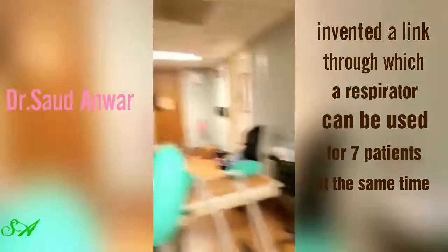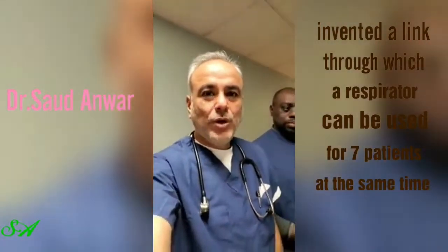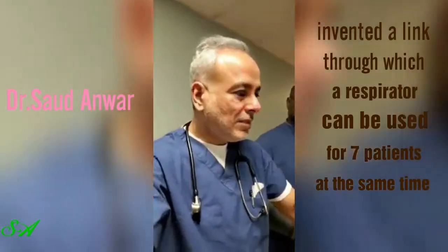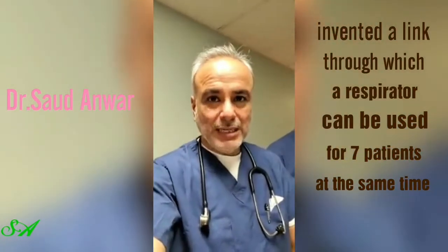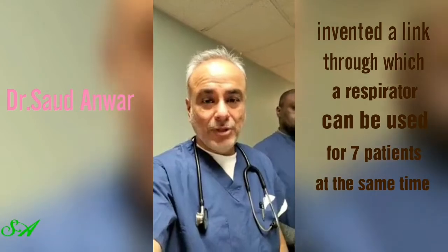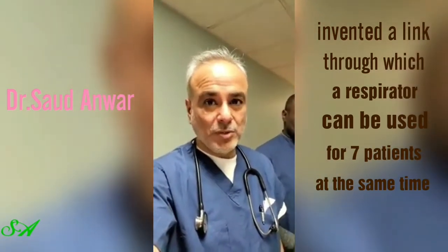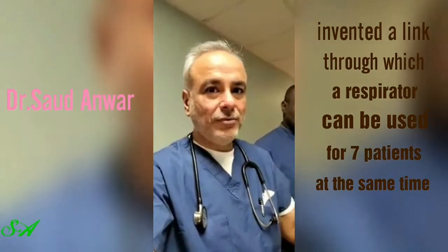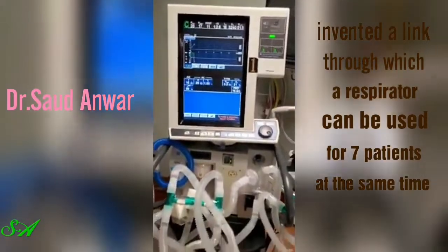Concept works. One more thing I'll add right now is that we did another thing where we were able to lengthen the tubes far more. Even when we lengthened the tubes, we did a pressure check on those. And with 20 feet of tube, the pressures and volumes were not impacted. Which is pretty fascinating, that you can have a single ventilator which can go to different places, and we would be able to take care of the patients.